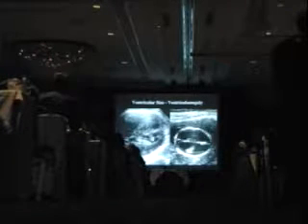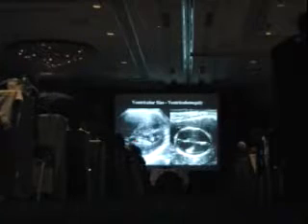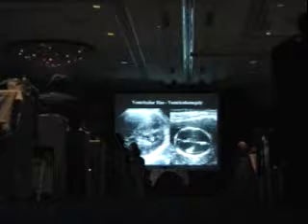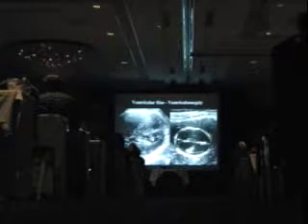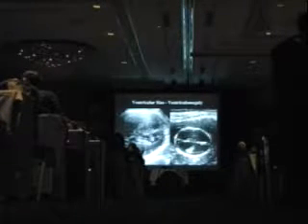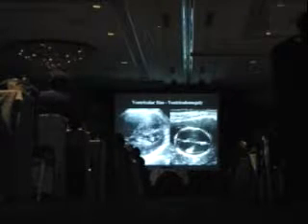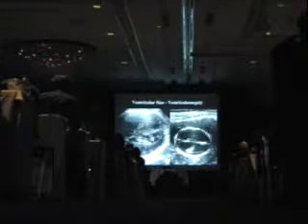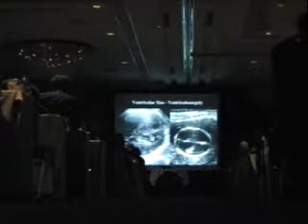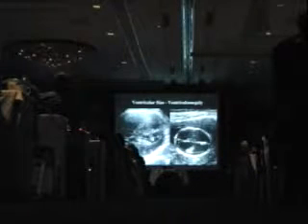Now, we measure the ventricular size, as I told you before, at the level at the end of the choroid plexus, at the level of the atrium, and that is a pretty constant measurement. You can also eyeball it and see that the choroid is drooping down and obeys the laws of gravity by drooping down towards the bottom. And it will very conveniently point you to the lateral wall of the lateral ventricle. So it is very convenient as a marker.